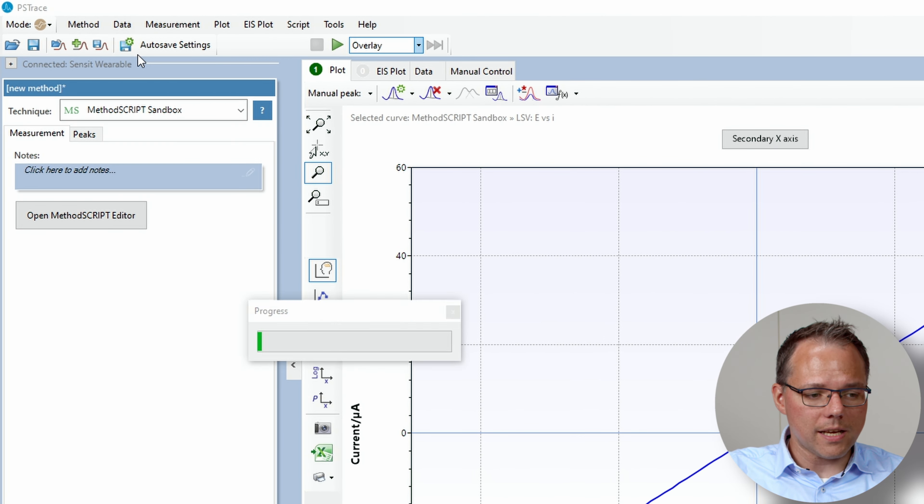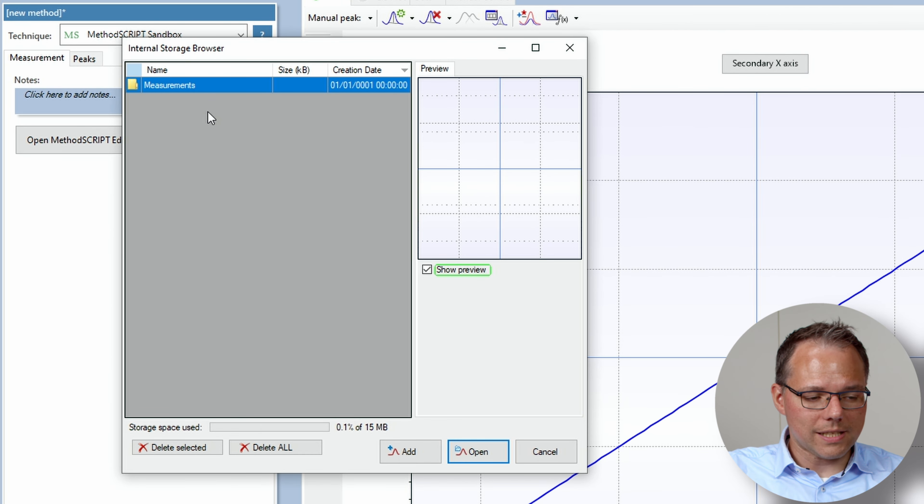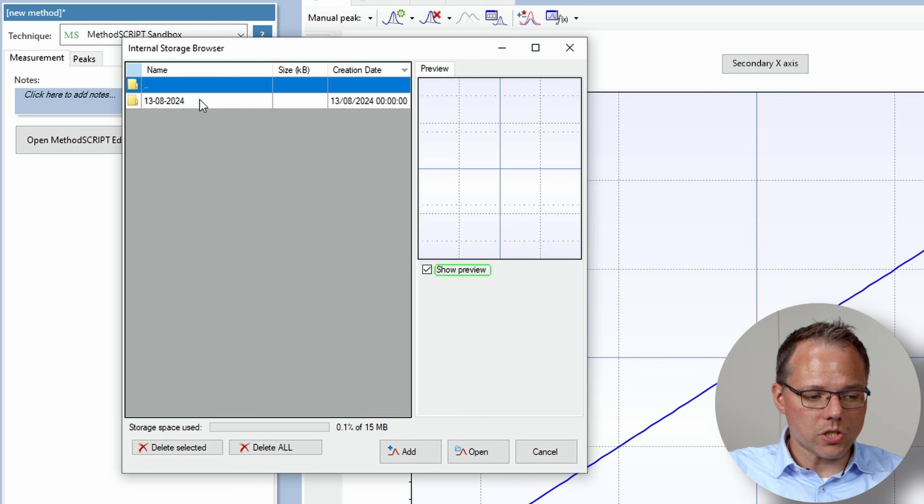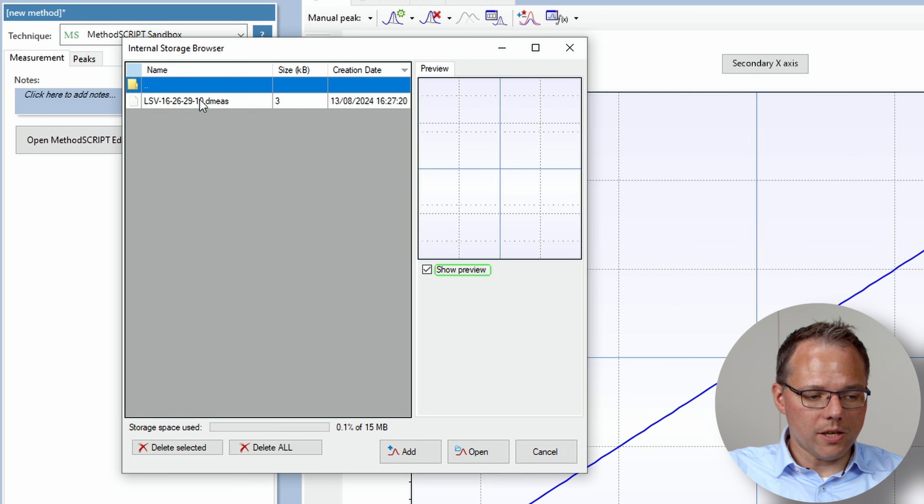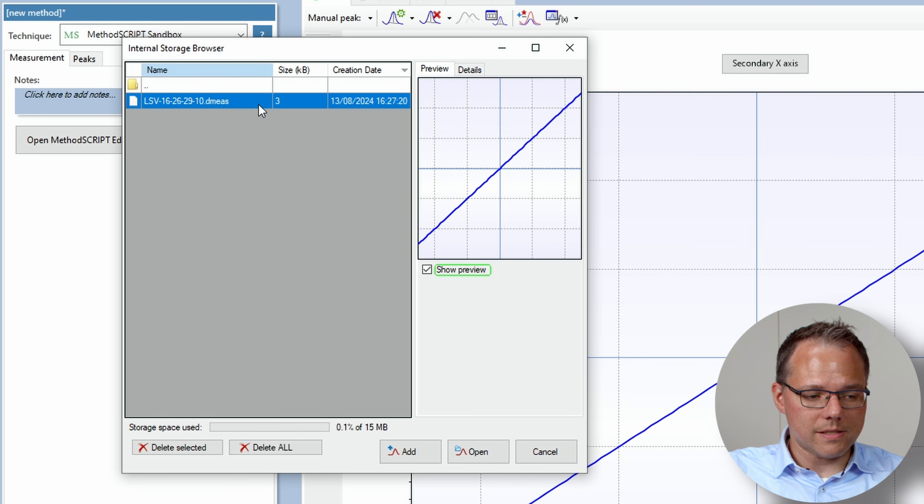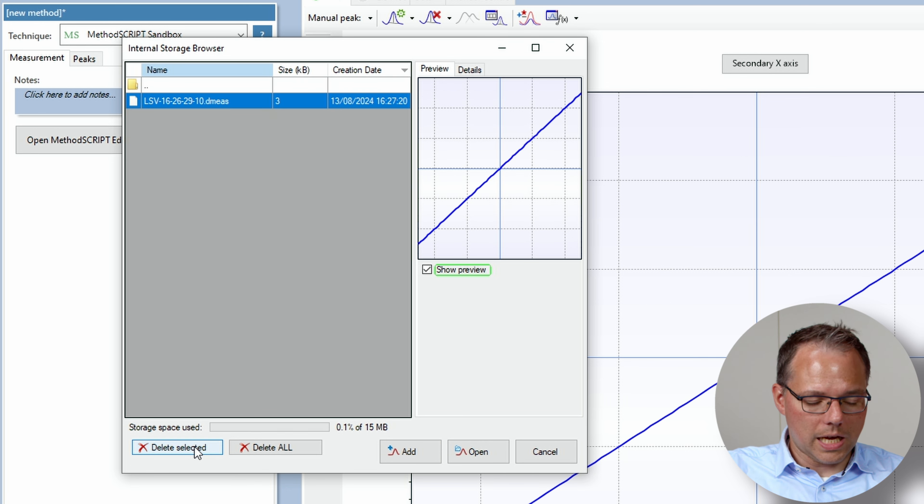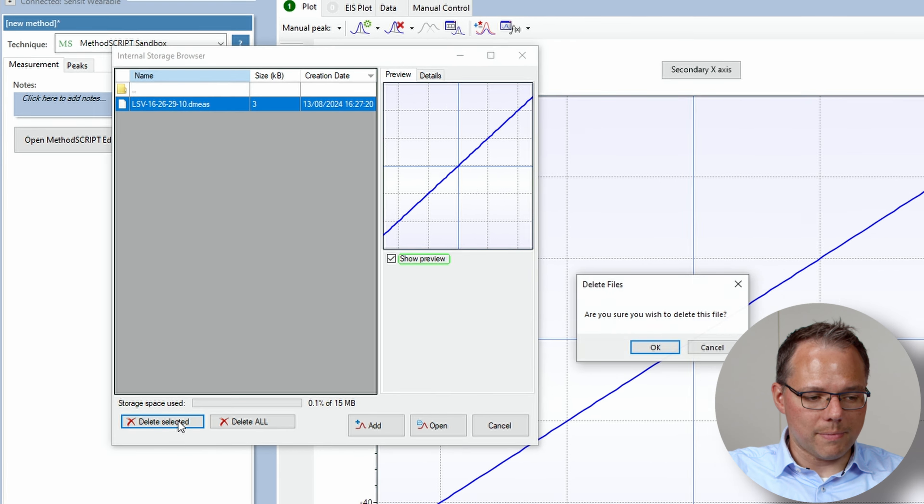I just go to data load data internal storage and then I go here this is the measurement that we just did and now I delete this measurement.